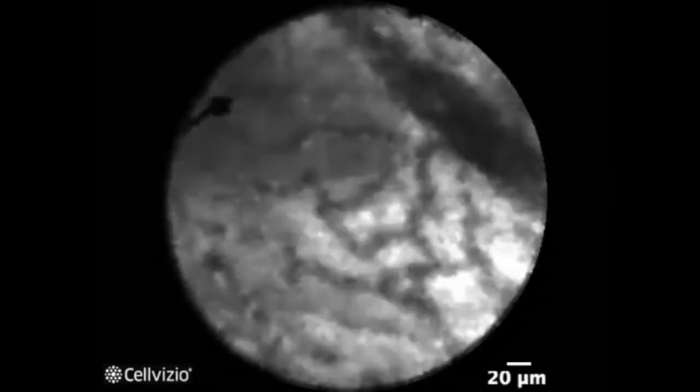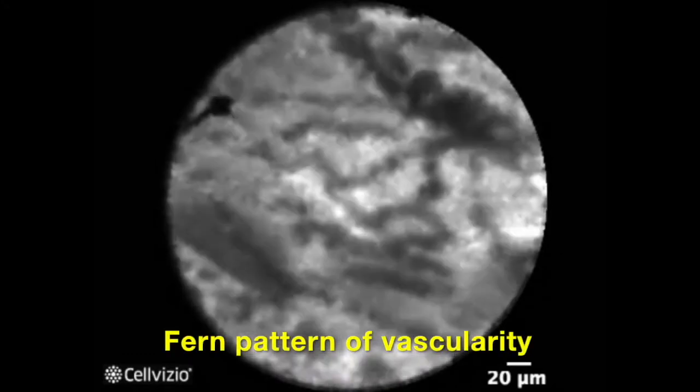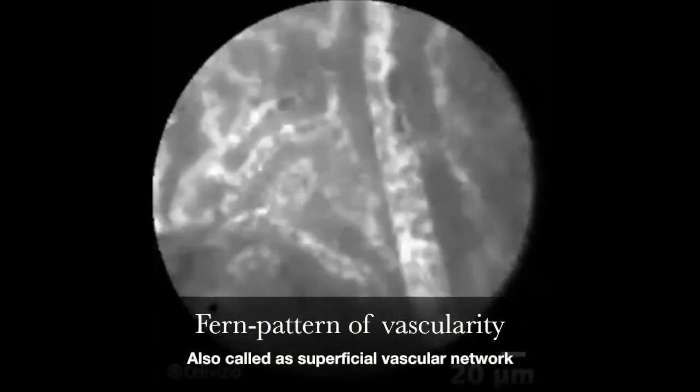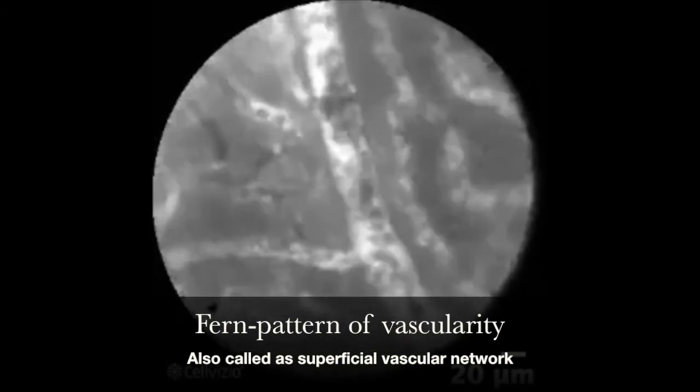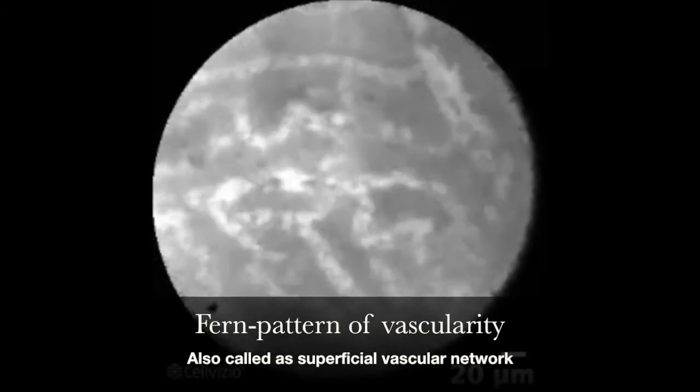There is a very characteristic Fern pattern as described, and here again there is a higher density of RBCs within those blood vessels. In this next example though, you see that the blood vessels appear much brighter compared to the previous example.